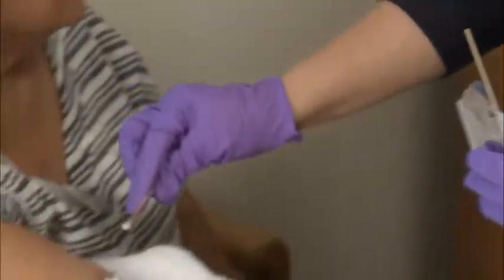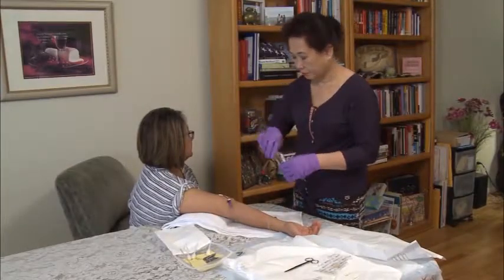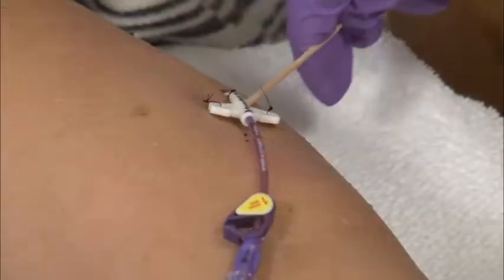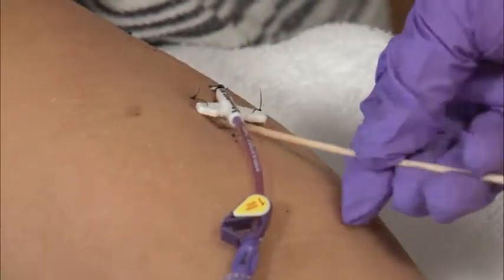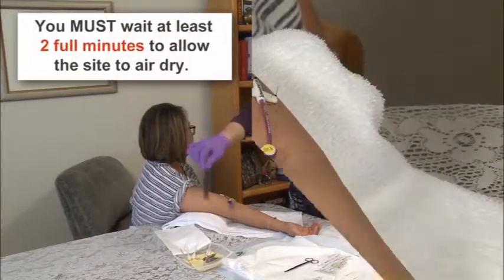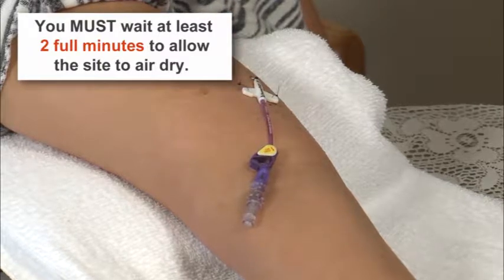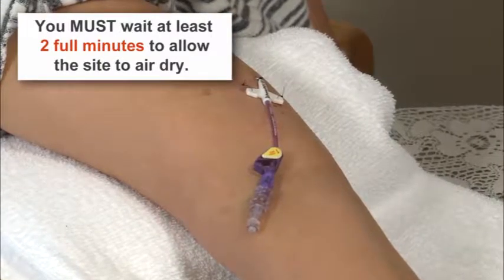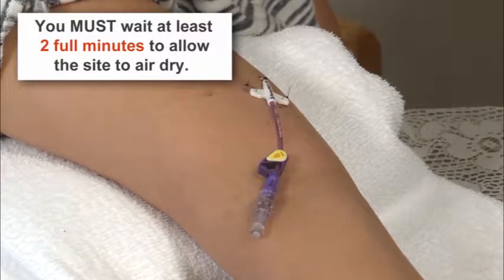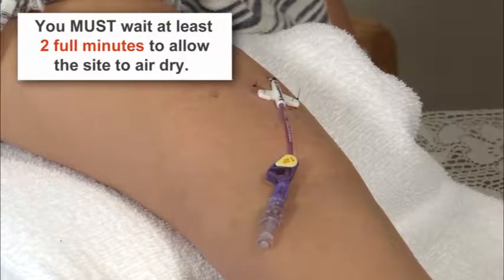Next, use the 2 Q-tips to better clean the hard-to-reach areas of the insertion site, the stitches and under the catheter wings. Once all the swabs and Q-tips are used, you must wait at least 2 full minutes to allow the site to air dry. Do not skip the drying step. It is during the drying time that the antiseptic kills the germs on the skin. Full drying protects better against infection.